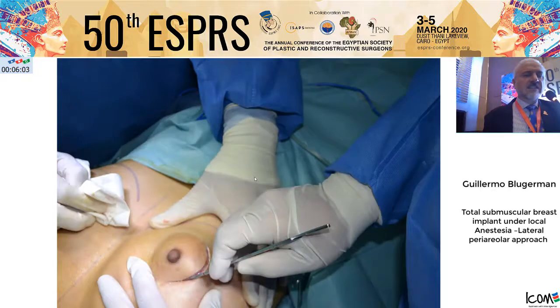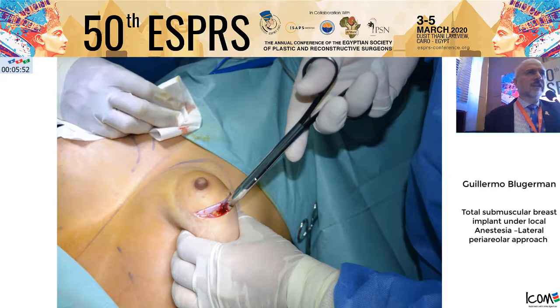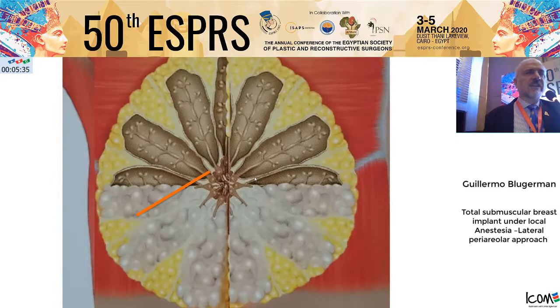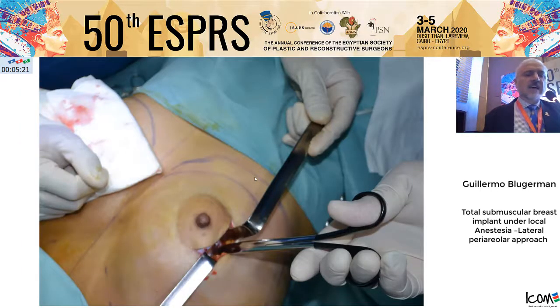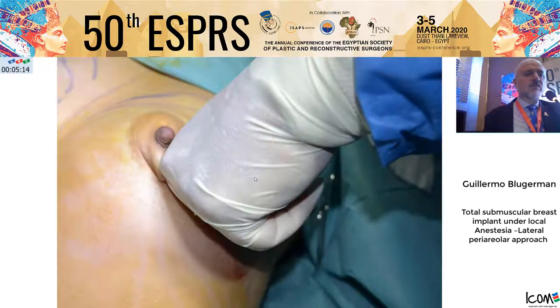We start with the incision on the skin — just skin and dermis — and after blunt dissection, we try to avoid damage to the glandular tissue to reduce the possibility of contamination, because the glandular tissue is not sterile. There are natural germs inside the breast tissue. In a radial action, we try to go between the acini, avoiding damage, until we arrive at the pectoralis muscle aponeurosis. We open the aponeurosis in the same direction of the fibers to go deep into the submuscular plane.